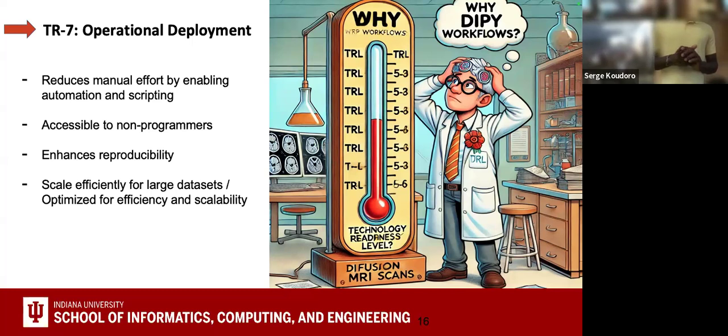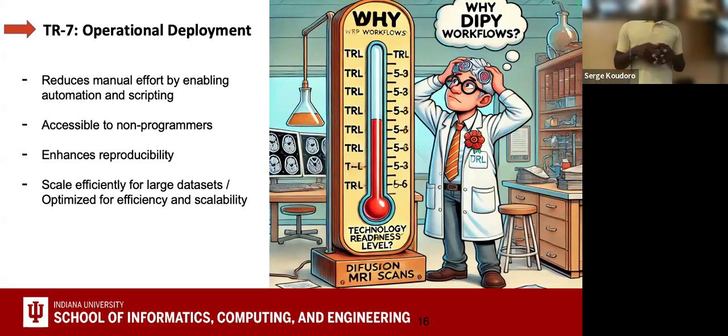So the question is about the different legal aspects if we have some clinical use data to certify our tools. For example, I would give you the example of Sherbrooke, who is a big contributor of DiPy and started a company that succeeded in getting a whole pipeline FDA approved, but under the hood, they had to accelerate some of the DiPy tools. So they have their own implementation to make it even faster.